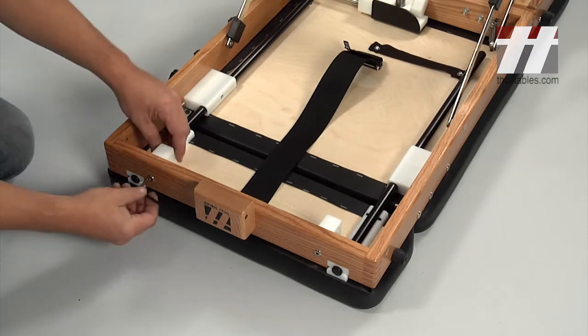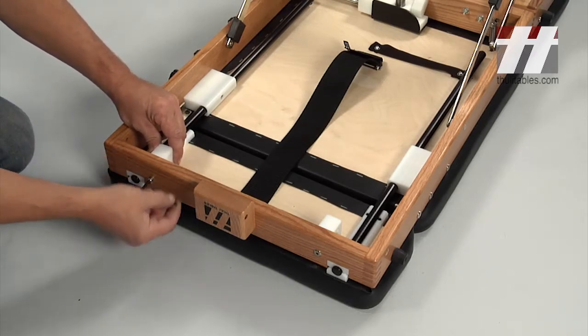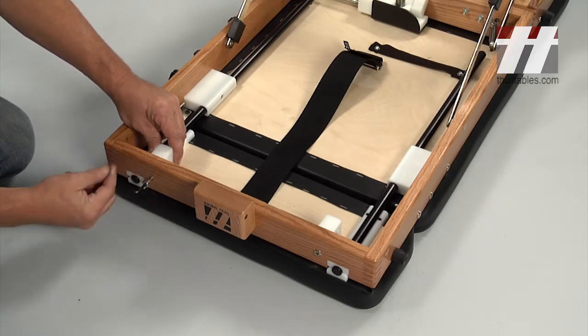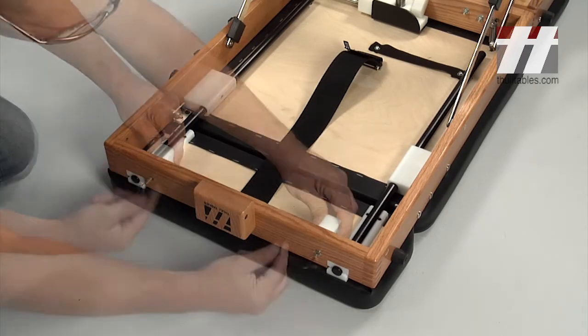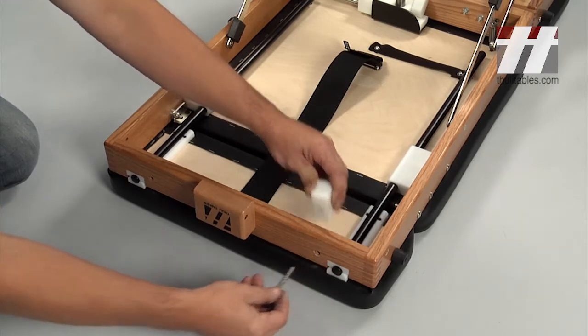Remove the original leg blocks using the Allen wrench provided. Be sure the Allen wrench is fully engaged to prevent the screw heads from stripping. Keep these screws for later use. Discard the leg blocks.